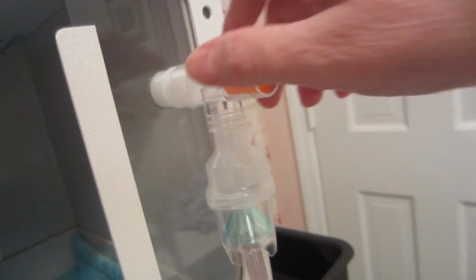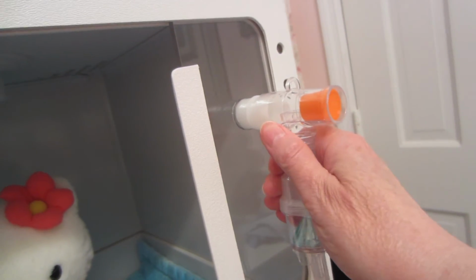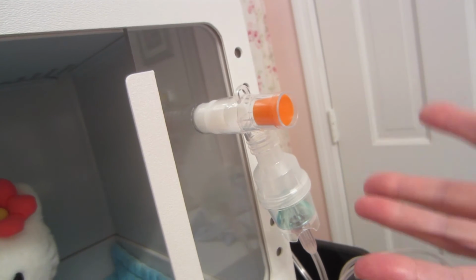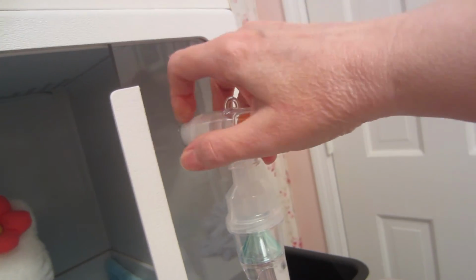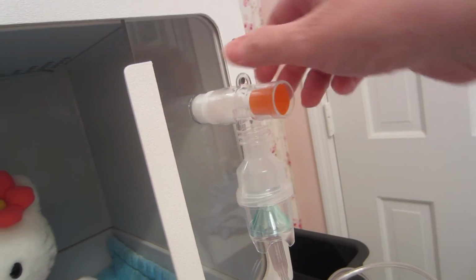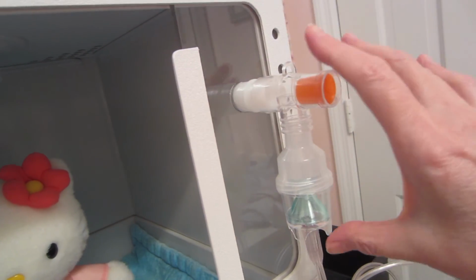One thing you need to also remember is make sure the nebulizer is straight. If it's crooked, nothing's going to operate properly. You're not going to get the correct airflow, and it won't use up all the medication. So make sure it's as straight as possible, and make sure it's not leaning in or out. You really have to get that at just the right angle. So that's the only tricky part that I've found so far.